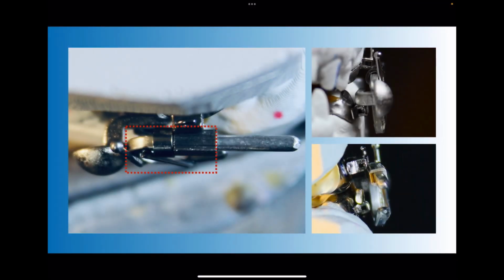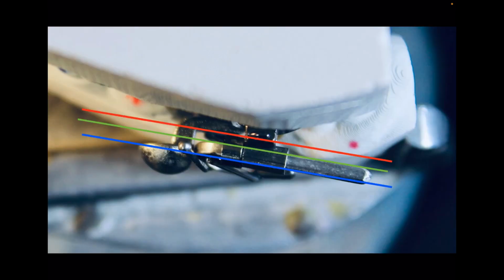Next here, as you see, we have very square engagement. And once again, to your upper right, you can see you have that 50-50 engagement with that cam. And then on the lower right, you can see that you're avoiding that archwire tube. If you don't have that offset enough, you can get locked into place. So be very careful of that.